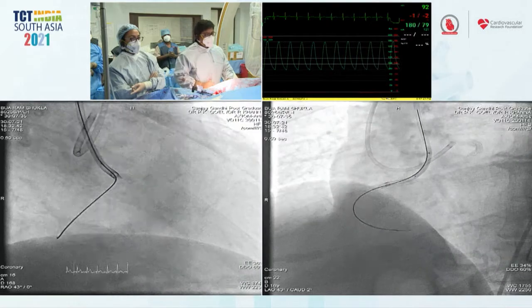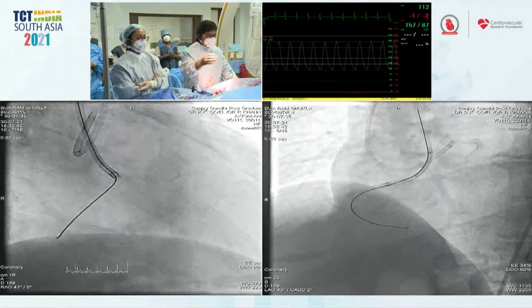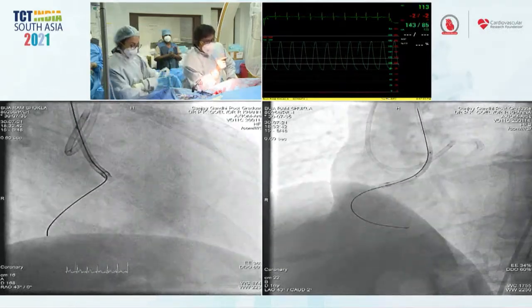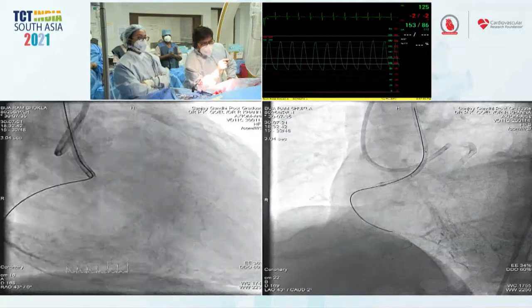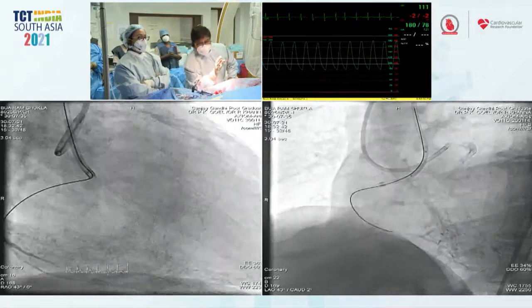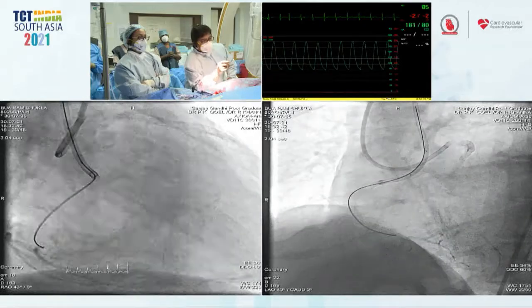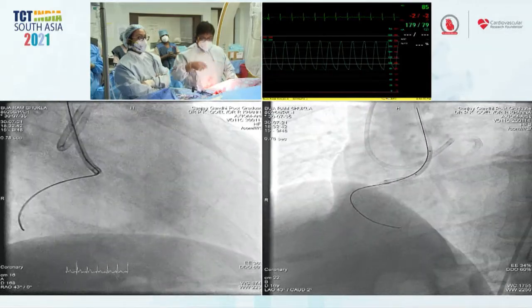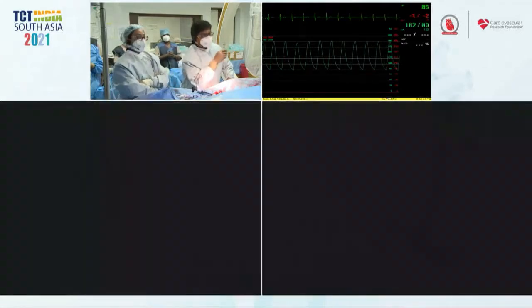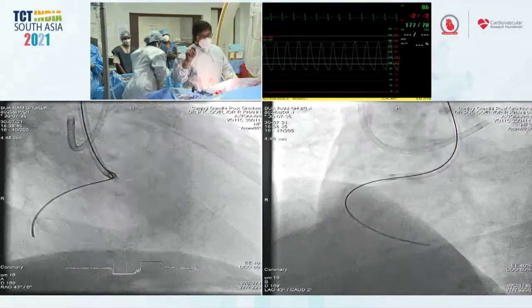Now you see, I am seeing from the contralateral side that I must be able to see the artery well enough where the distal tip of the wire is. Because if I can't see it, then I will not be able to succeed. The other trick that we do is to prepare the Stingray balloon. I think the Stingray balloon has still not come. No, sir. In the meanwhile, I changed this wire to Miracle 12.